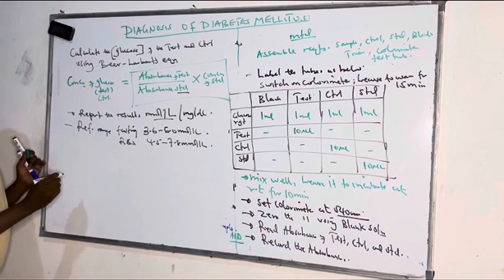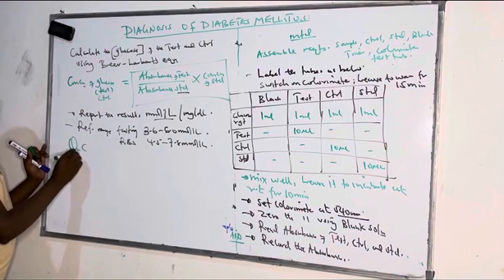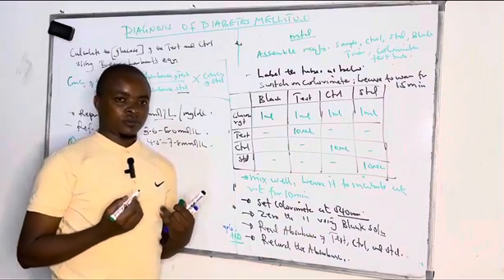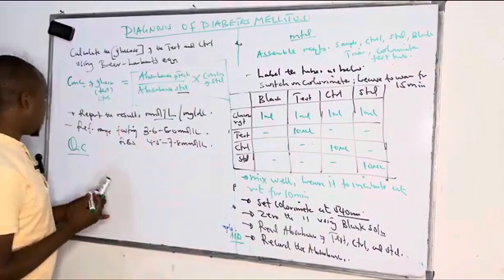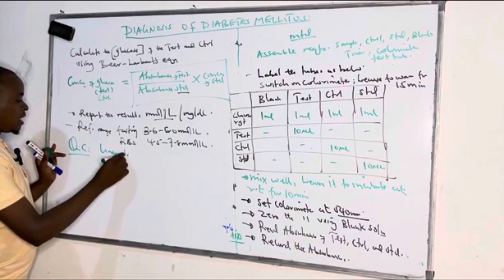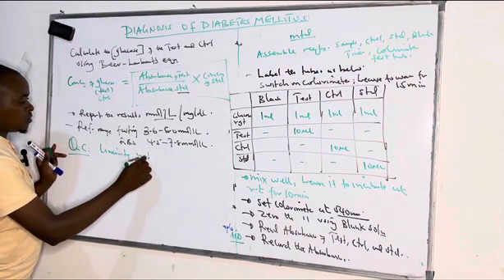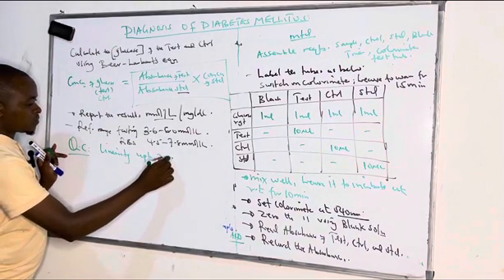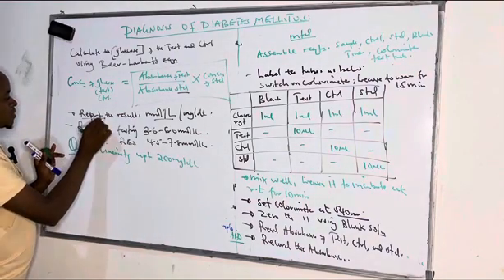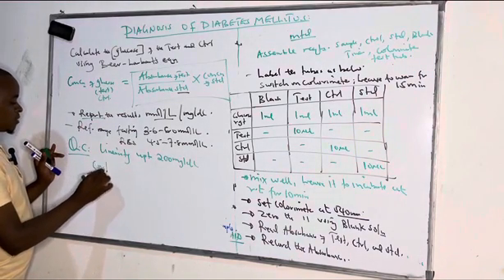Whenever you are asked this question, you should always include the QC, whereby quality control is the key in the laboratory. Quality control is the linearity. You check on the linearity, which should be up to 200 milligrams per deciliter, and to consider these results, the control should pass.